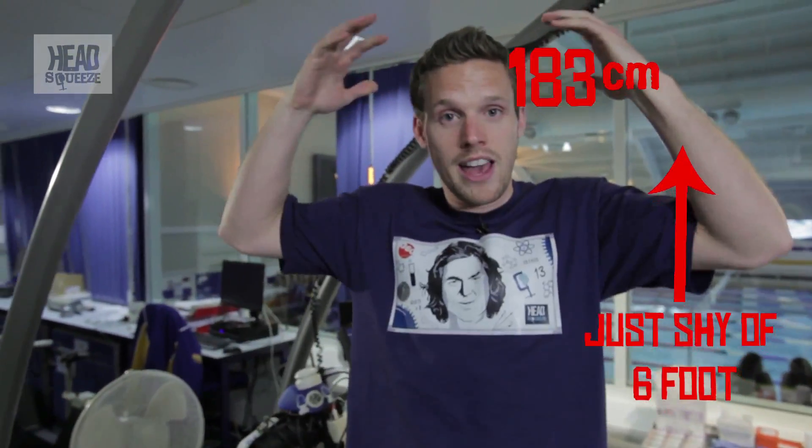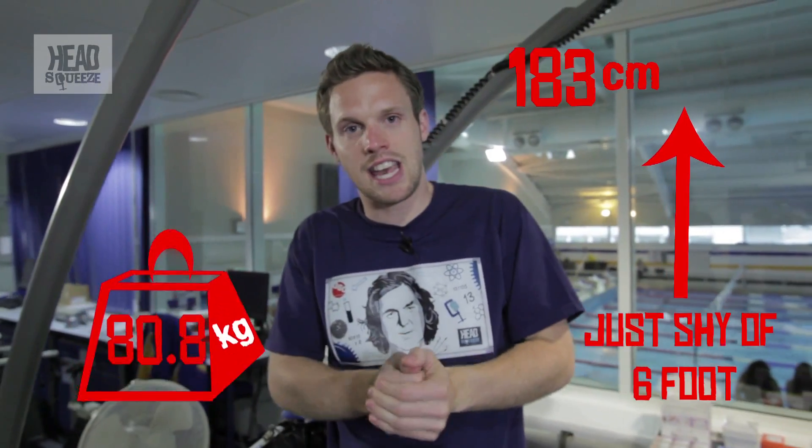First things first: I've got a heart rate monitor on, I've had my height and weight measured, and now I need to get a face mask on so we can measure my oxygen levels.